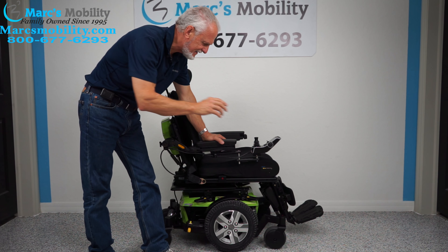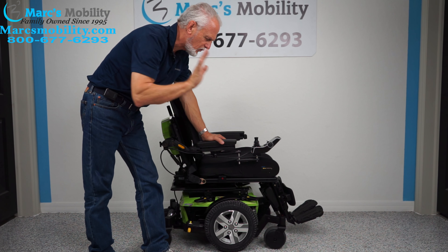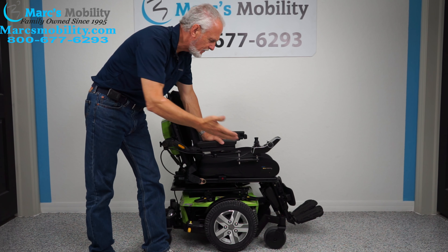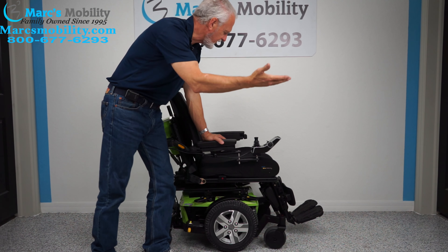It has the electric tilt, the electric recline, and the electric feet. So it has three electrical functions: electric tilt, electric recline, electric feet.